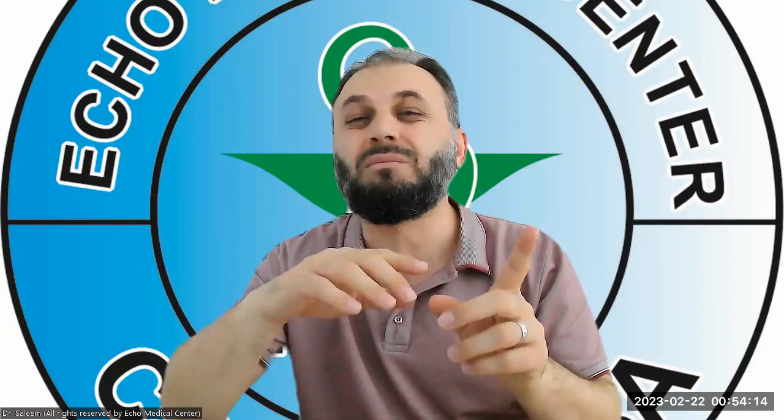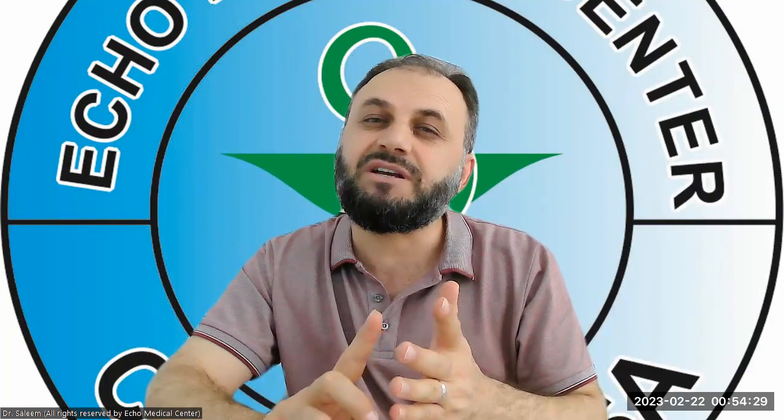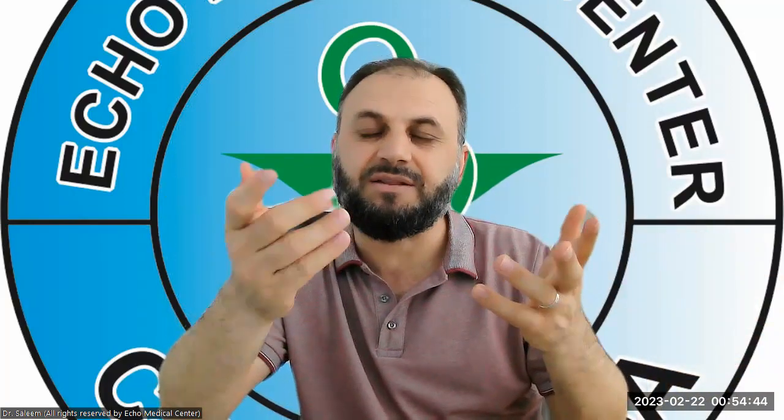Here, the box can be in any direction, but most commonly, to make it easier for you guys, for the proximal and distal CCA, right or left, it doesn't matter, if you steer the box to the right, it just helps. But anyway, I'm not a big fan of steering the box right or left. It has to be the correct angulation to see the maximum Doppler shift, to see the flow. Then after the color, you take the pulse wave Doppler. Try your best to put your sample volume or gate in the center of the vessel. You guys understand why we put it there: because we find the highest parabolic flow there, and to see the peak systolic velocity in that area.